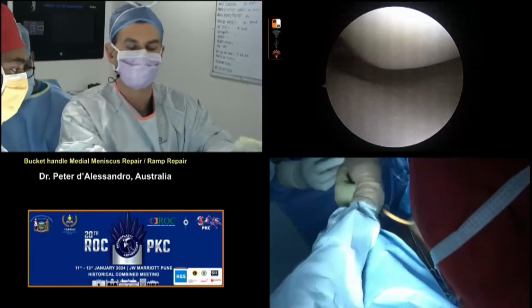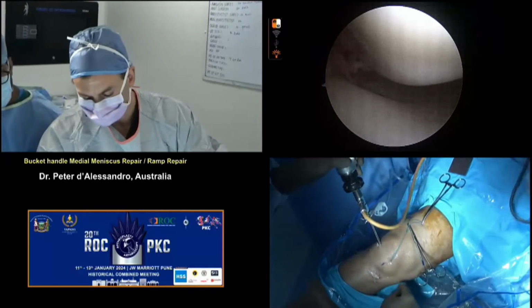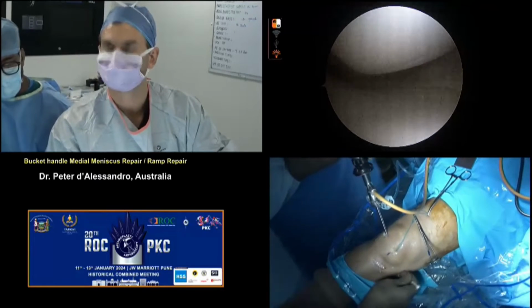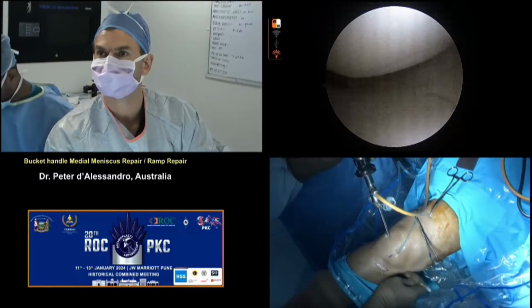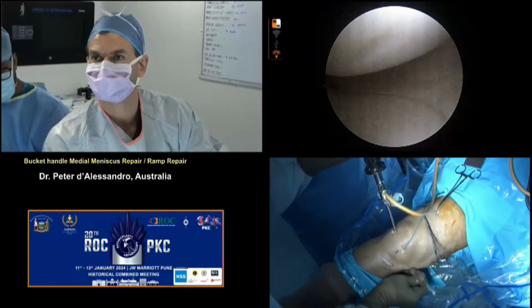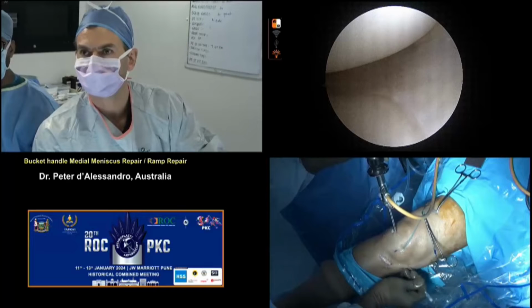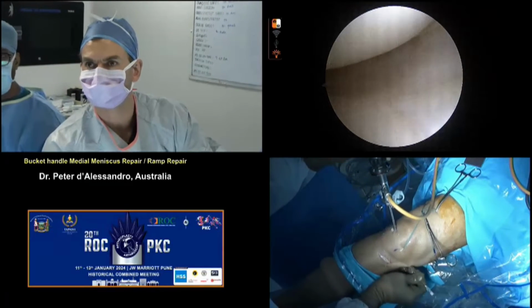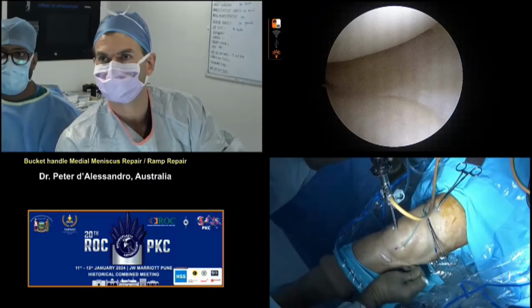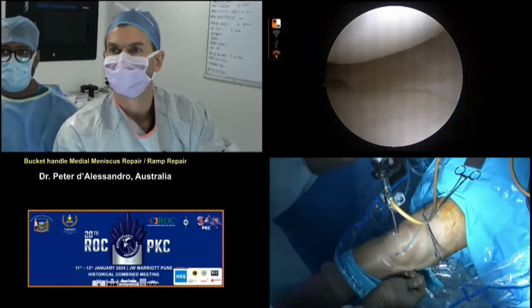So we're here on the medial side, and although his access is okay, I would like a little pie crust, so if we just have an outside shot there. So we're going to aim for a little menisco-femoral pie crust here, so we can see I'm on the superior side, just trying to improve my access ever so slightly, and I'm just placing a slight valgus force.